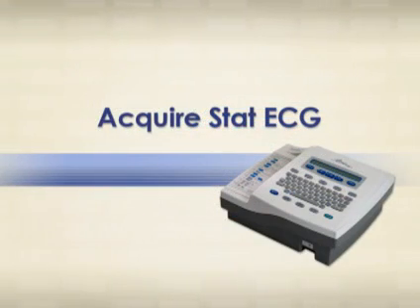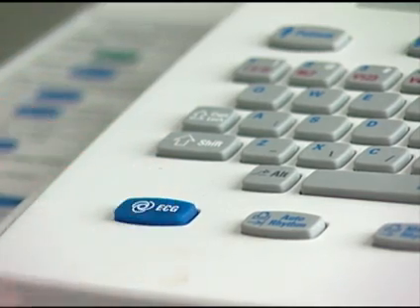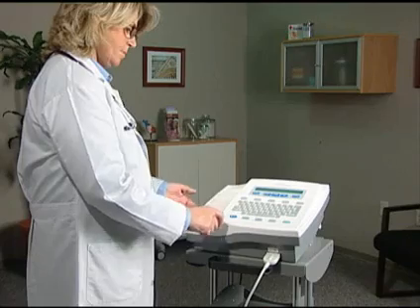To generate a stat ECG report, press the blue ECG button twice. Press Stop to cancel at any time.